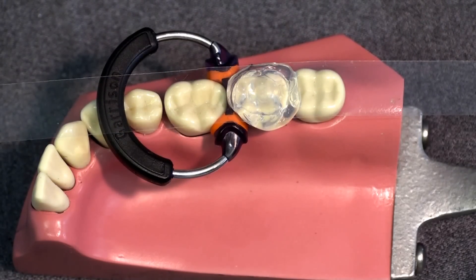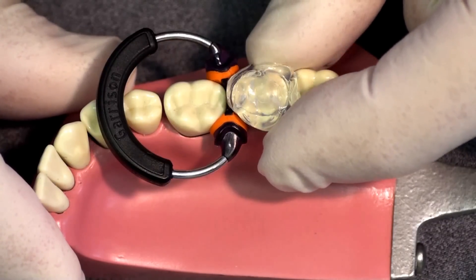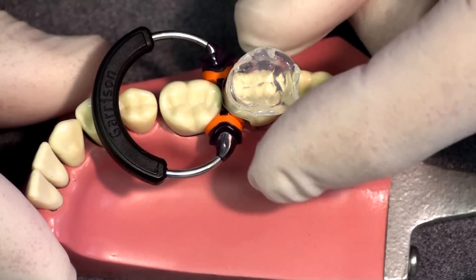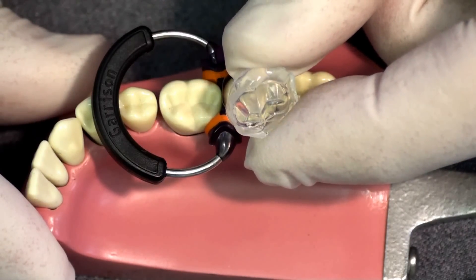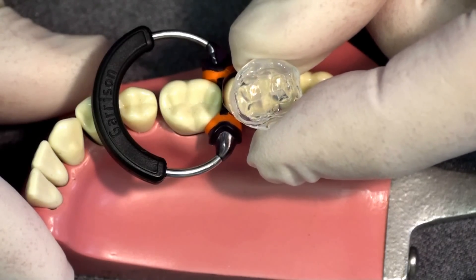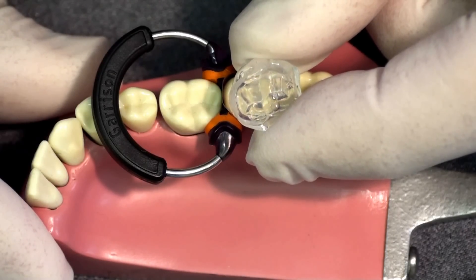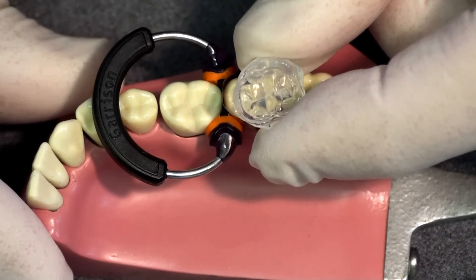The material sets in about 45 seconds in the mouth, so by the time it's set the patient still hasn't gained full anesthesia, meaning you have not lost any chair time. The mylar strip comes right off, and the impression — being a polyvinyl siloxane bite registration material — comes right off the tooth. This is a very exacting impression of the occlusal surface that we can use to reproduce the unset composite later and achieve an exact reproduction of anatomy, occlusion, and surface texture.